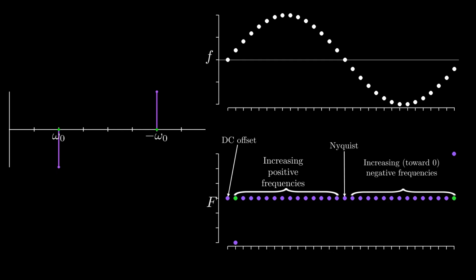Finally, there are specific units to frequencies used here. Consider the full range of the input function f. I'll call this the field of view of our input function, perhaps foreshadowing some MRI application later. If the independent axis is time, this would be the duration of the acquisition. If it's space, it would be the full distance we're sampling over, etc. The units of frequency in FFTs is cycles per field of view.